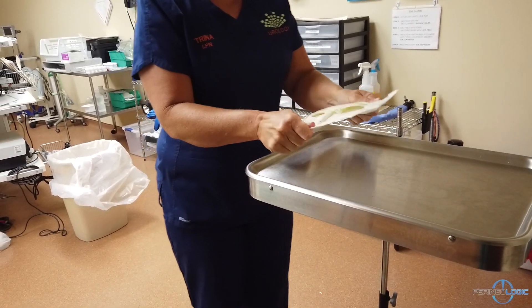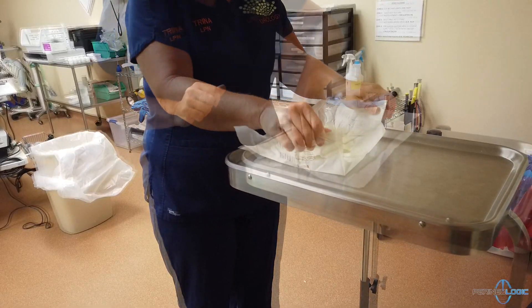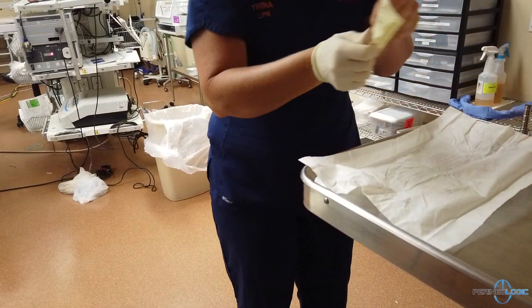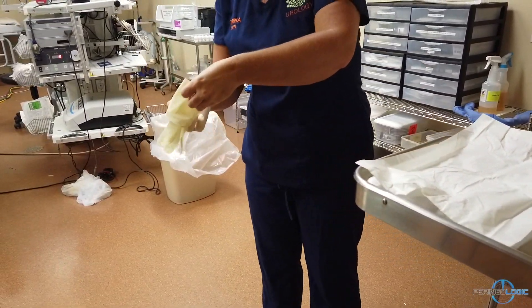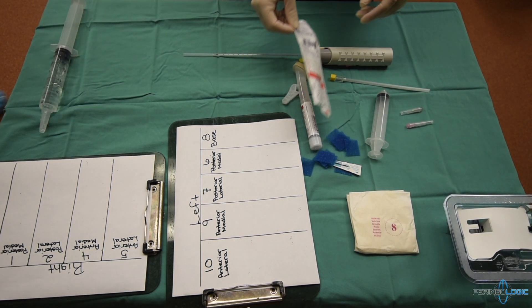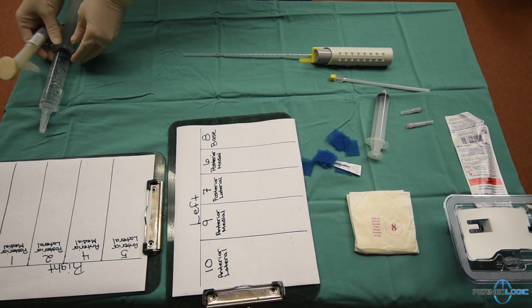The nurse puts on their sterile gloves before finishing up the setup. The first thing that will be used will be the Duraprep and then the lubrication slurry.